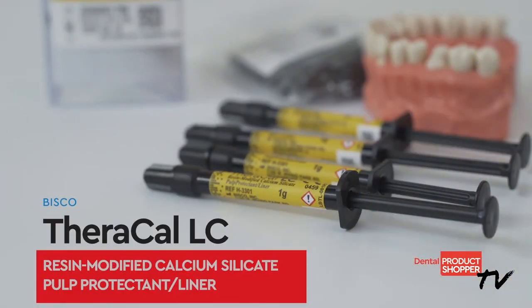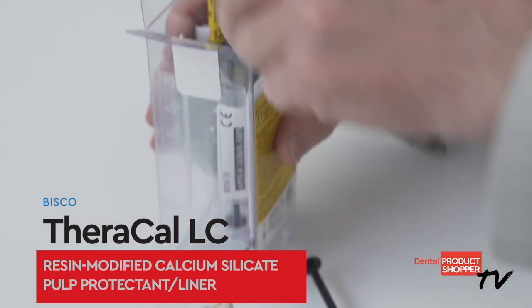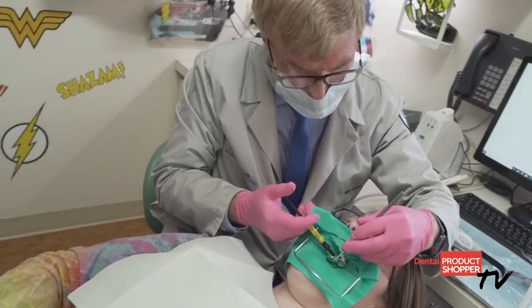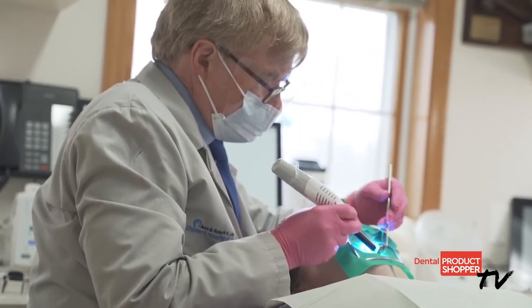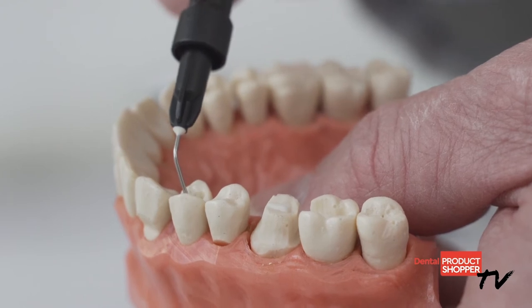The TheraCal LC kit comes with four one-gram syringes. TheraCal LC is designed for ease of use, as material is delivered directly into the preparation on moist dentin in one-millimeter increments. The thin needle provides for easy placement in deep preparations. Now let's take a look at what independent evaluators at Dental Product Shopper had to say about TheraCal LC.